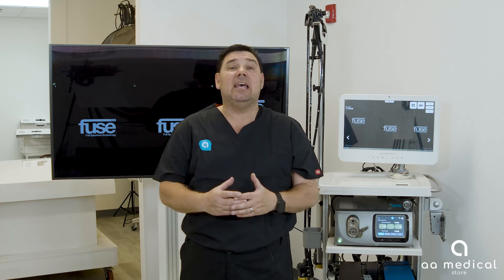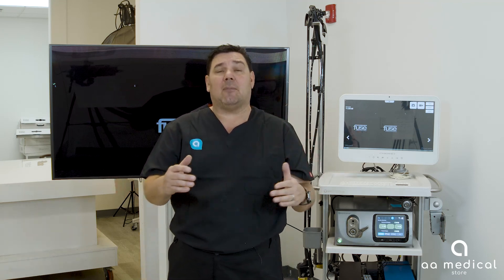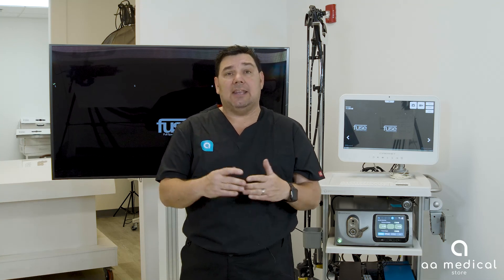The way this works is the Fuse system is built with the colonoscopy scope to have three cameras in it — a right camera, a left camera, and a center camera — which increases your field of view. One of the biggest metrics in endoscopy or GI is the ADR, the adenoma detection rate, which is improved by being able to see 330 degrees as opposed to 170 degrees.